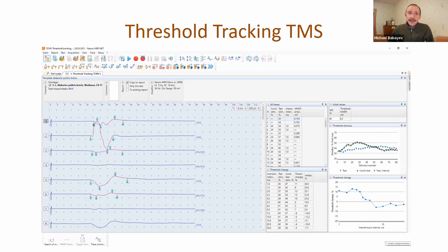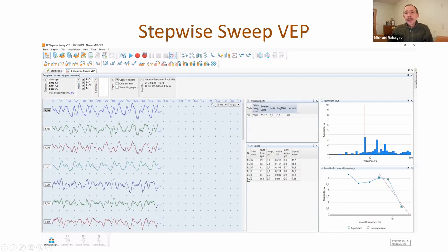During this technique, our system tries to hunt for the threshold - the arrest threshold. You can see blue dots here - we try to maintain the same level of threshold. Here is the result in a graph: you can see the inter-stimulus interval on one axis and threshold change on the other. We can see inhibition and facilitation. This technique is used for examining the inhibition and excitation circuits in the brain.